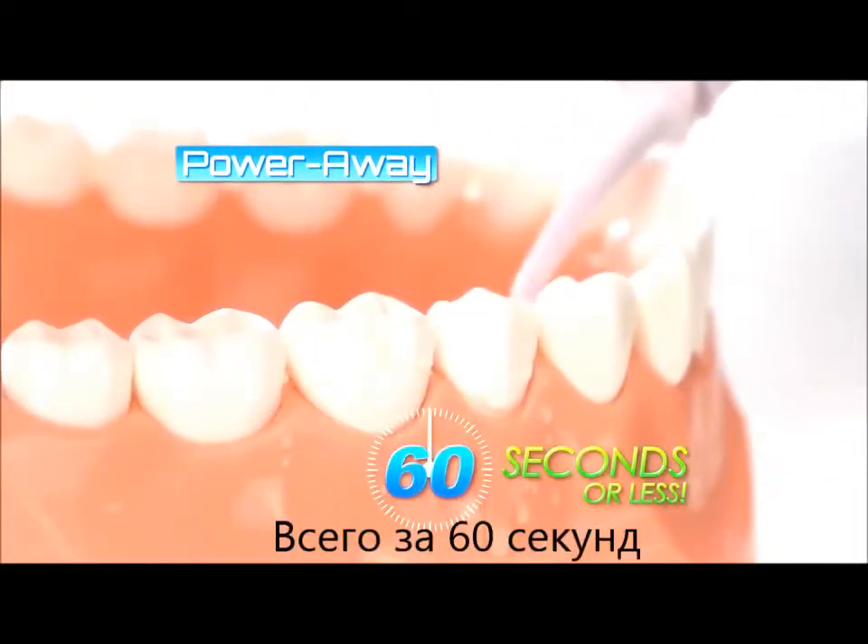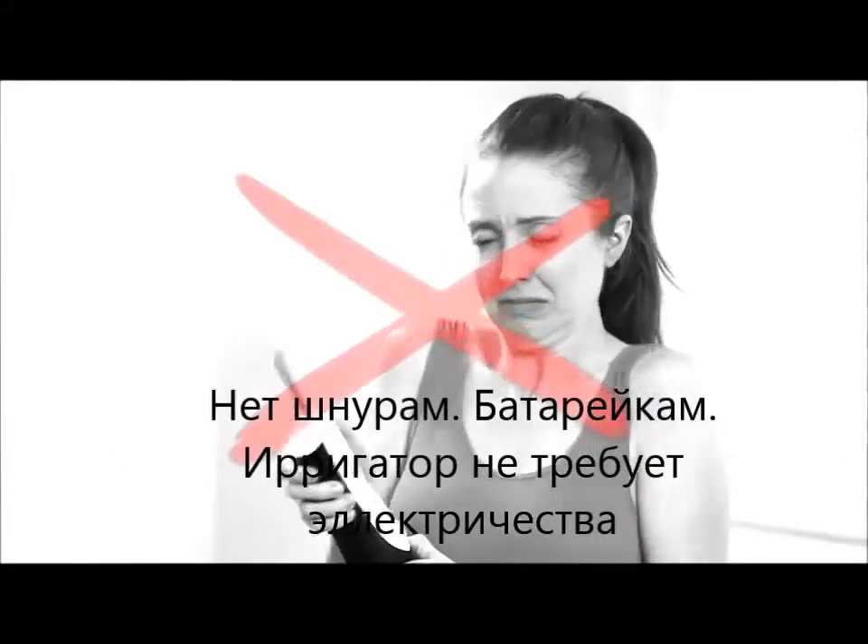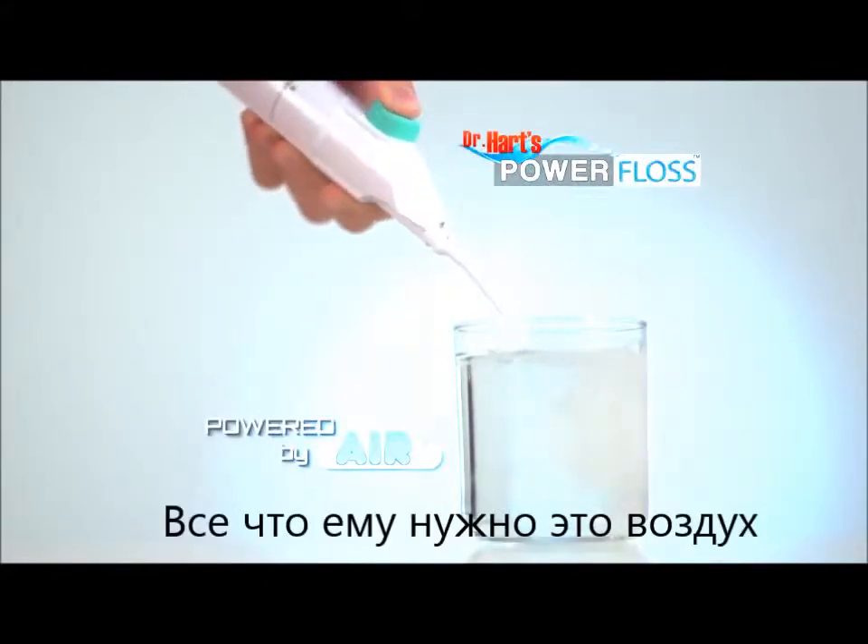In 60 seconds or less. No cords, no batteries, no worries — because the Power Floss is powered by air.